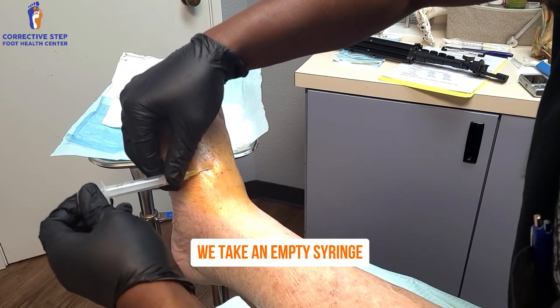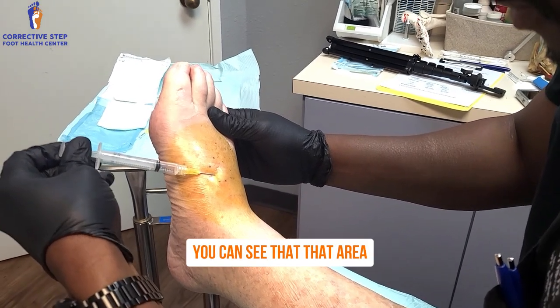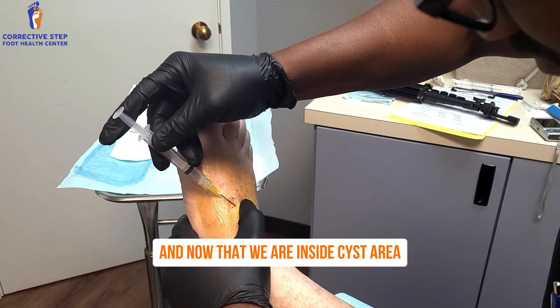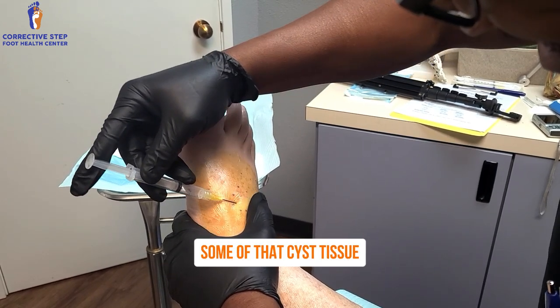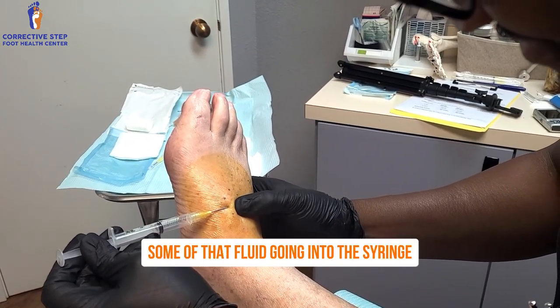We take an empty syringe and an 18-gauge needle and we use negative pressure. You can see that the area where the cyst is at gets white — we call that blanching. Now that we are inside the cyst area, you can see palpating and trying to break up some of that cyst tissue so it actually starts going into the syringe. And now you can start to see some of that fluid going into the syringe.